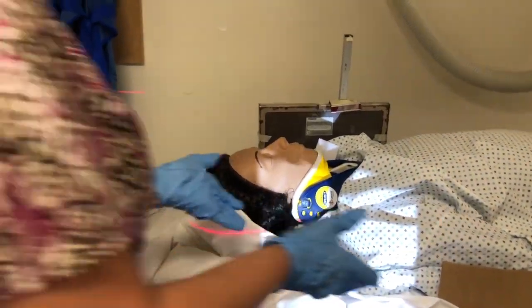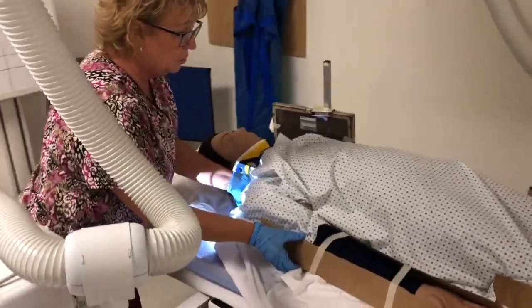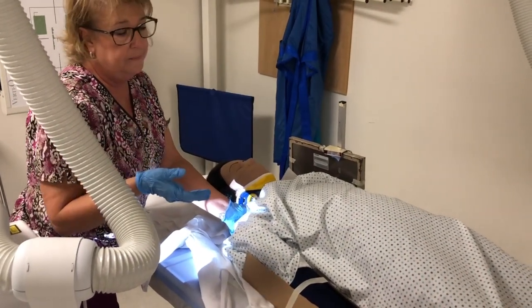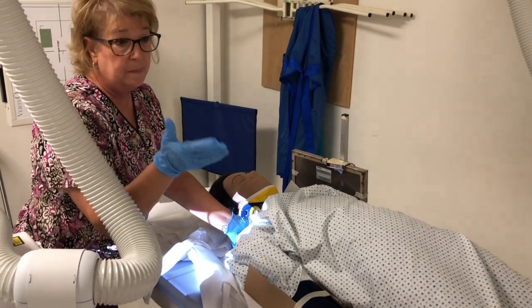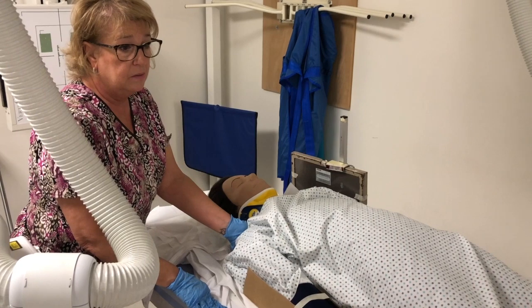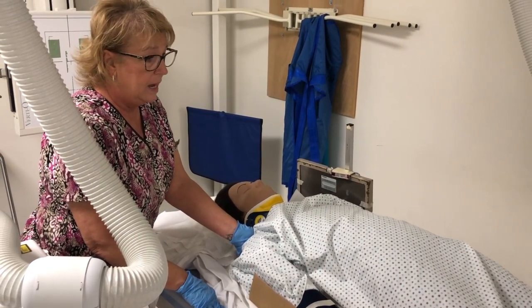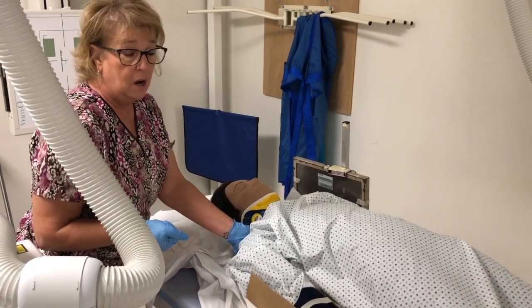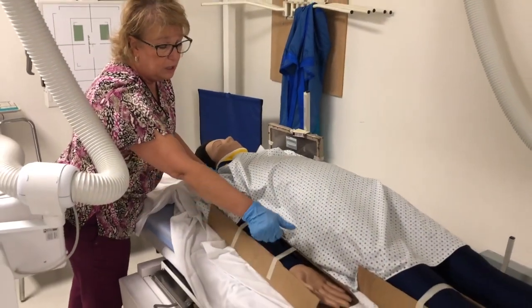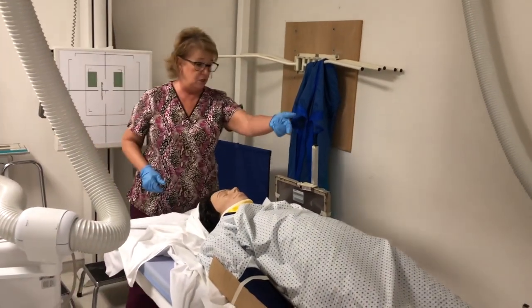And because we do have one injury here, what I'm gonna do is try to just depress her shoulder as much as I can, and then I would ask a technologist, maybe an ED physician, someone else who is willing to put on a lead apron, and I would have them pull traction on the arms. Now we can't pull traction on this arm, but perhaps we could grab the splint, and then he also could grab the patient's other hand.